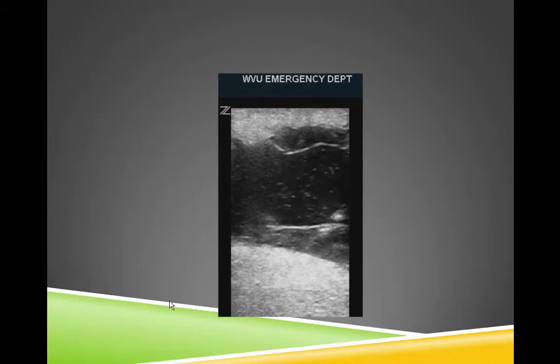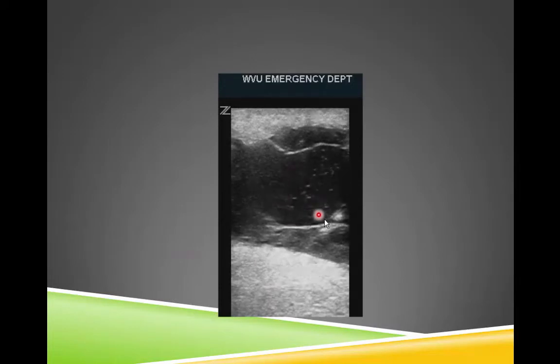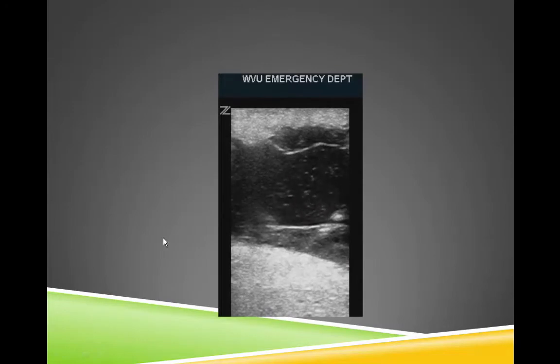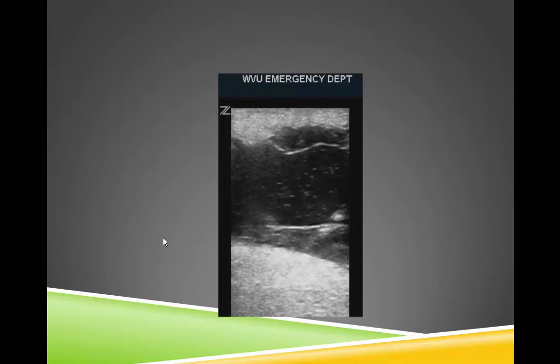And then sometimes you might see something that I affectionately refer to as pussystolsis. I can't claim that I made that word up, but I like it, where if you push a little bit, you'll get the pus inside this abscess to swirl a little bit. Peristalsis can look a little bit like this, but this is an area where we're not really worried about bowel, so that's called pussystolsis, or the swirl sign. But that's another piece of evidence for pus inside of a fluid collection.